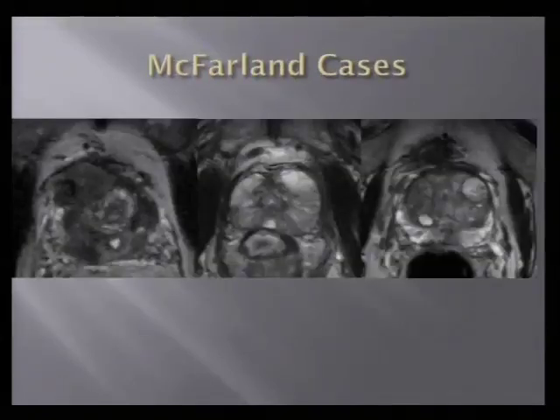And just to remind you what normal looks like, the middle one and the one on the right, that's what someone who does not have extracapsular extension looks like. On the far left is what someone who does have extracapsular extension looks like.